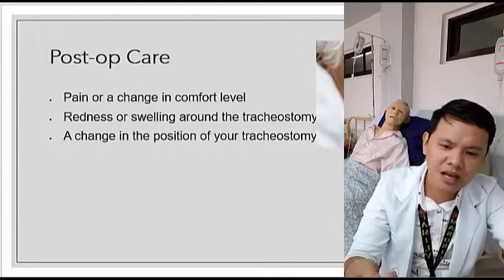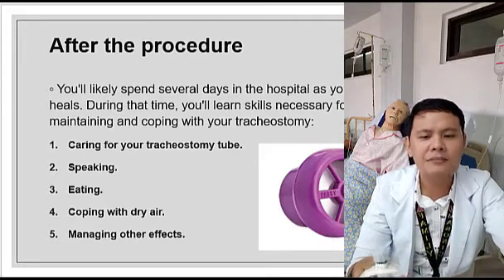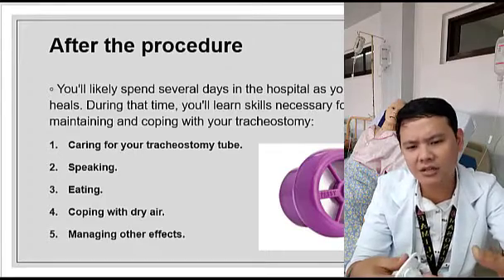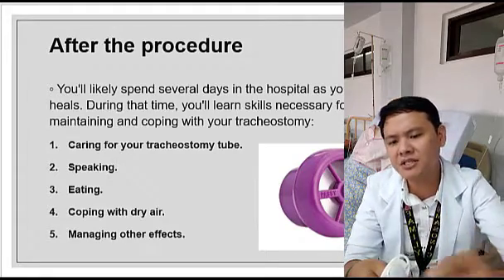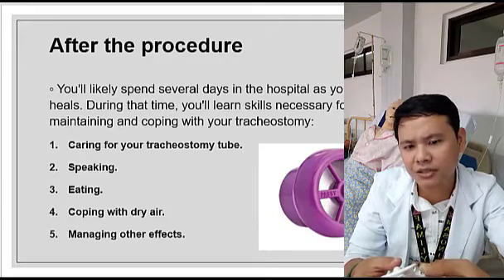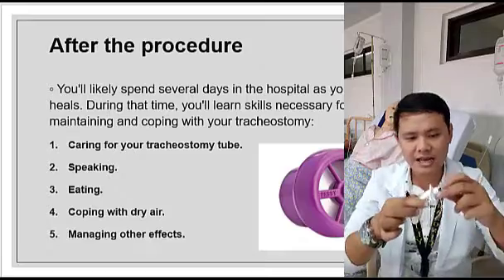What else? After the procedure, you will likely spend several days in the hospital. Hindi po pwedeng after the operation, uwi ka na. No, you cannot. Your body needs to heal. And also, your body needs to adjust. During that time, you'll learn skills necessary for maintaining and coping with your tracheostomy. So, after the procedure, expect mo that there will be some instruction about caring for your tracheostomy tube. The nurse or even the speech therapist will tell you about the proper care of the tracheostomy tube. Tuturuan ka paano ba mag-care. Yun yung i-demo ko sa inyo later kung paano ang paglilinis ng tracheostomy.